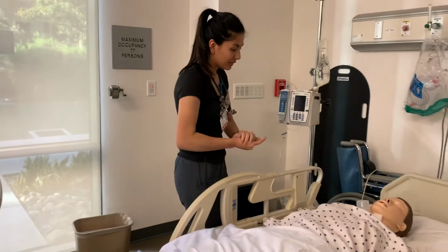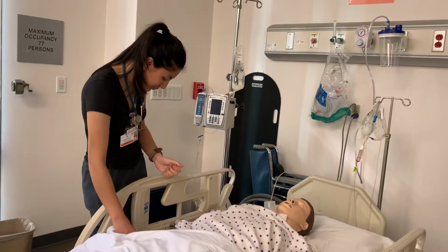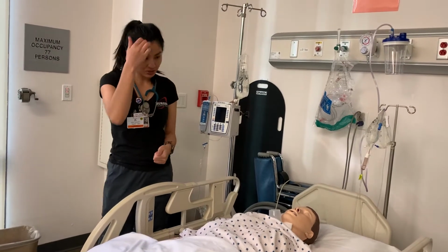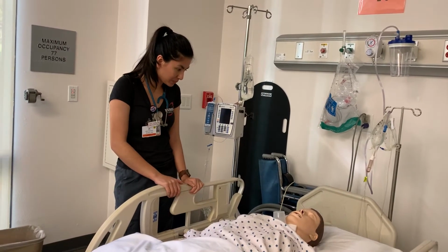Hi Jane, my name is Awaz. I'm going to be your nurse today. Can you please verify your name and your birthday for me? Alright, Jane Tripp, 10/31/53, perfect. I'm going to provide for privacy. So Jane, today I'm just going to be suctioning out your trach to help you out.